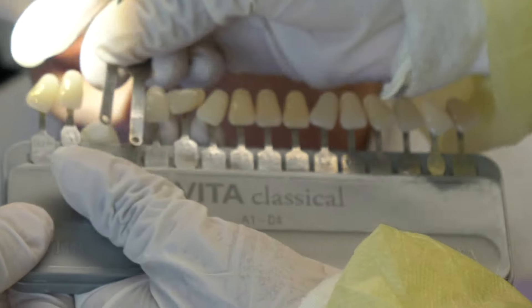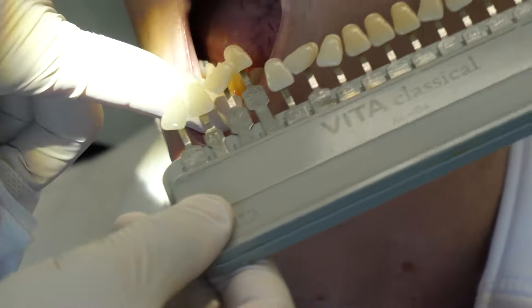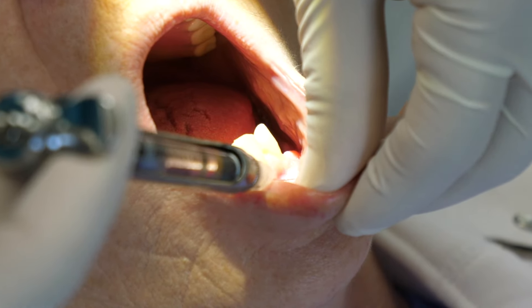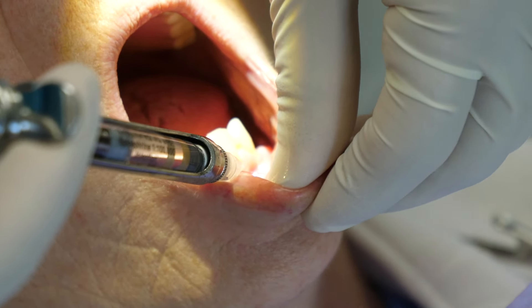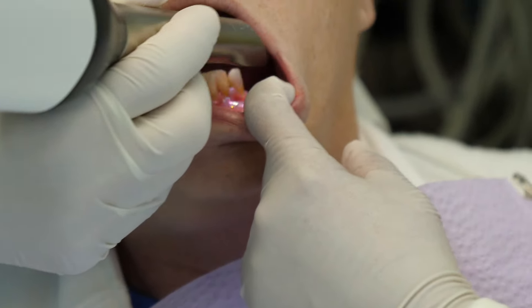First, the dentist and dental assistant will pick a shade for the crown. They use something called a shade guide to help them match the color of the rest of your teeth. Once they pick a shade, it's go time. The dentist will numb you up so you will feel comfortable and not feel a thing throughout the entire procedure.